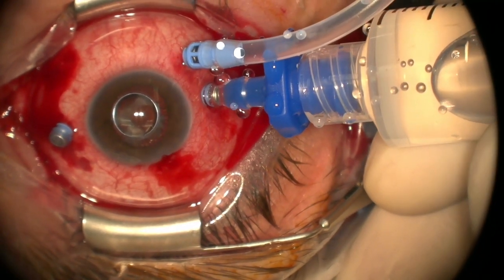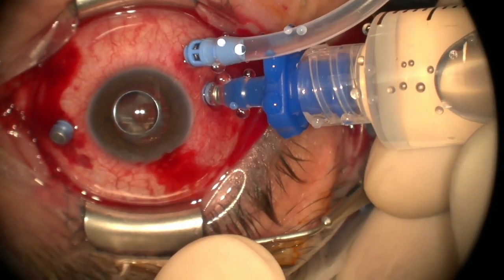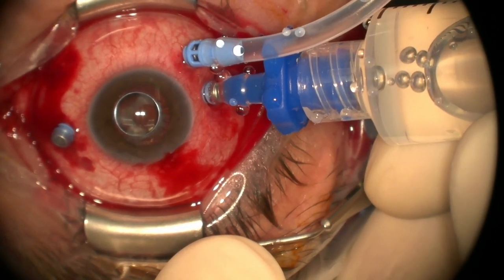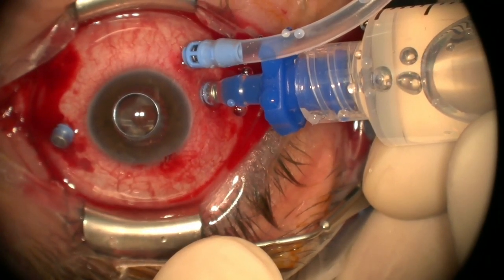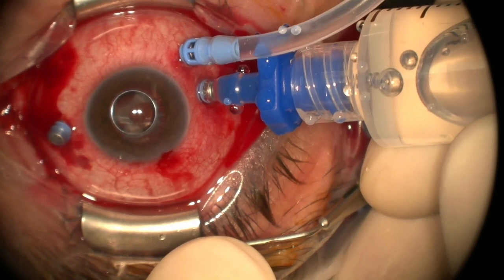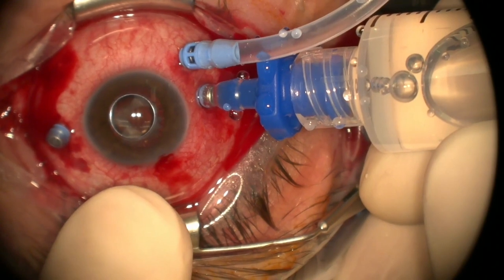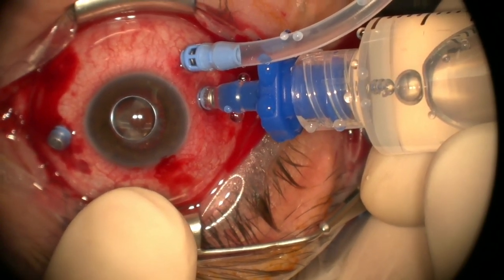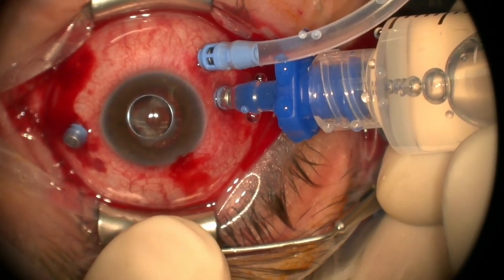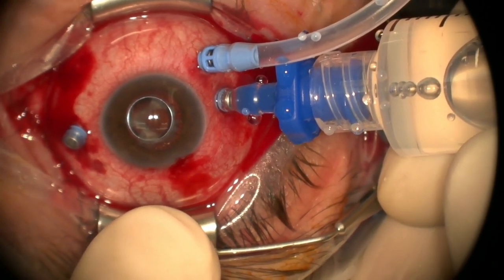And the oil continues to come out. You're just not seeing it in here, but it's doing just fine. And our plan on this is a couple of things. Make sure the retina is attached when the oil comes out. There's always a risk of retinal re-detachment. Published numbers can be as high as 20% when taking out silicone oil.